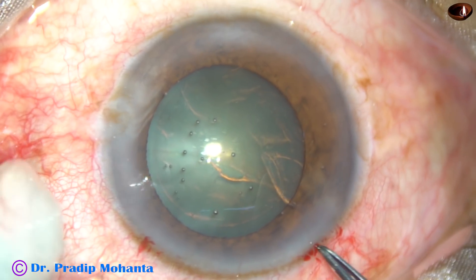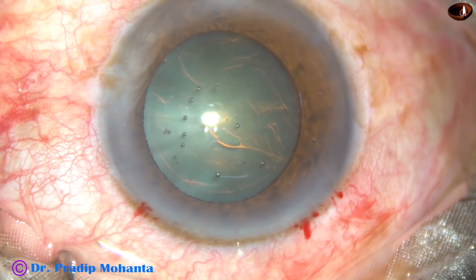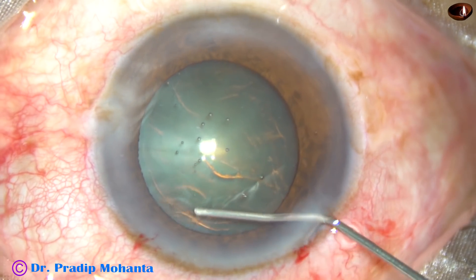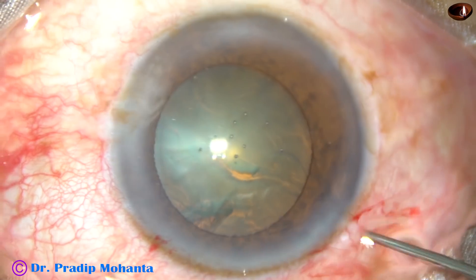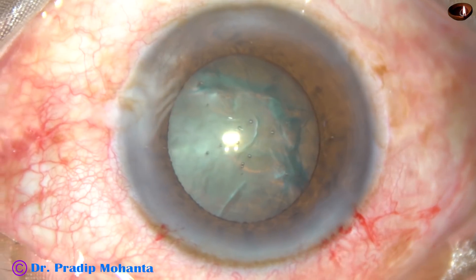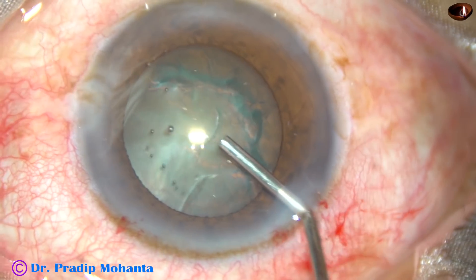And now, hydrodissection. The posterior leaf of the main wound is depressed, some viscoelastic substance is expressed out, and then this fluid is injected. We could see the fluid wave going from this side to the opposite equator. Now the nucleus is mobilized and we could see that the nucleus rotated nicely.